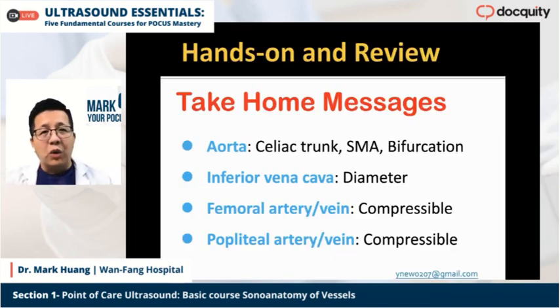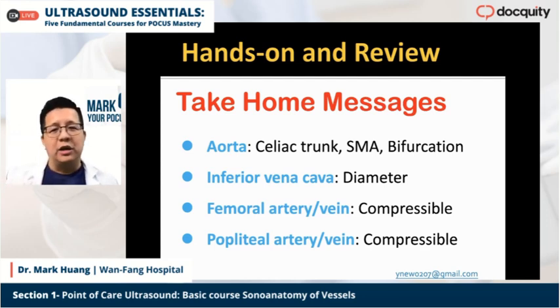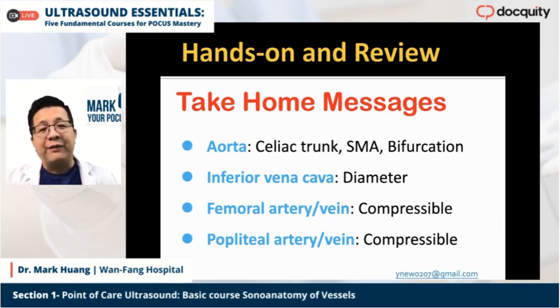So do the hands-on by your own, review, and just hold your probe and apply it on your patient. It's no harm, no pain, just try. Before next time, I hope everyone online tries the celiac trunk and SMA bifurcation, finds the inferior vena cava and measures the diameter, and finds the two major big veins, the femoral vein and the popliteal vein. Are they compressible or not compressible?